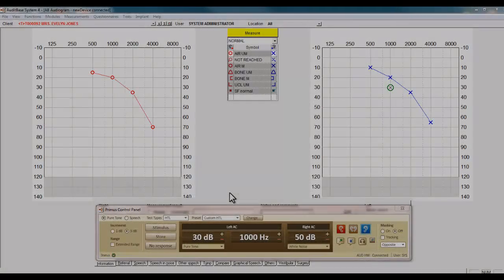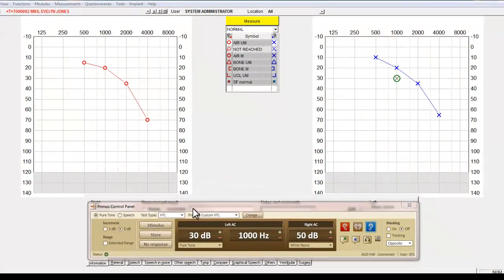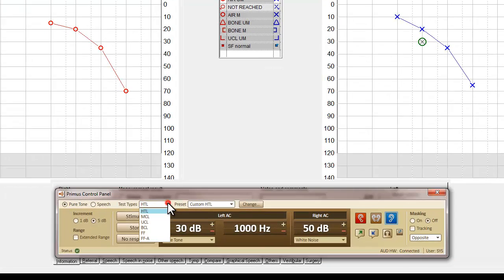With air conduction now complete, we can move on to bone conduction by selecting BCL from the test types menu.